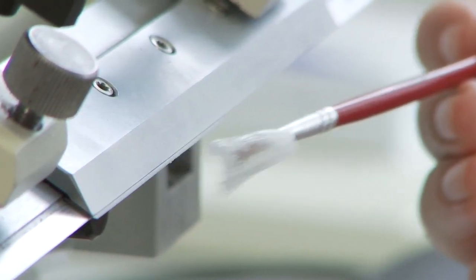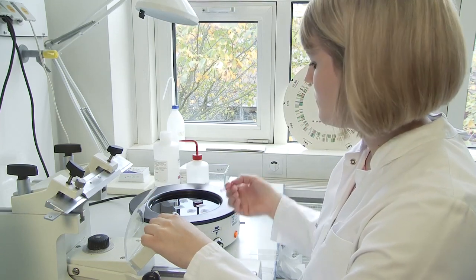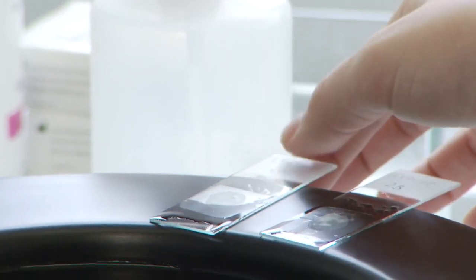However, while previously we were manually evaluating individual genetic mutations, today we want to evaluate a whole lot of them and do this quickly with a high sensitivity. This is only possible using high-throughput technologies that have a high level of automation, not only when it comes to DNA extraction, but also during the sequencing process and applied to an end-to-end bioinformatics pipeline for the precise analysis of data, identification of relevant mutations, and determination of the best therapy.